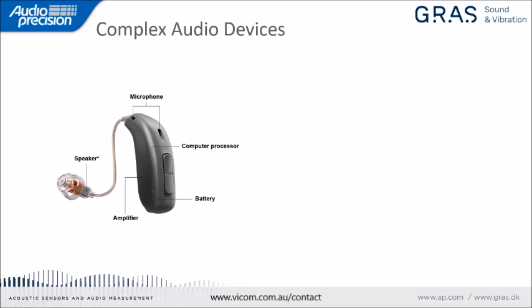This is a rather large behind the ear hearing aid that fits behind the outer ear. But as we'll see, there are some tiny ones that are completely hidden inside the ear canal. Now, in addition to these basic features, hearing aids have a lot of additional features, or they can have, such as noise reduction.